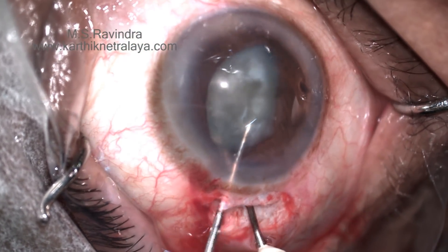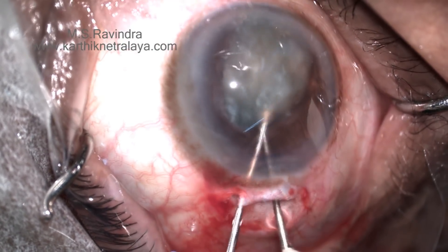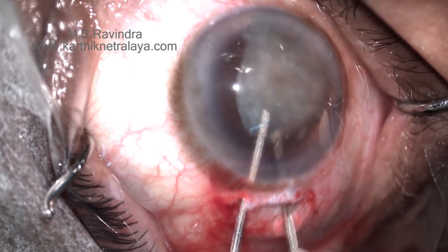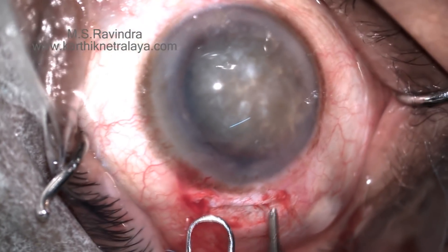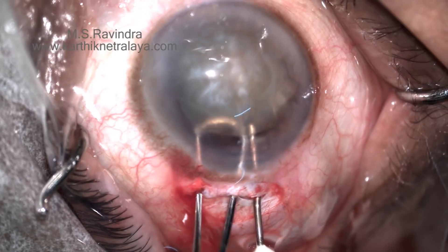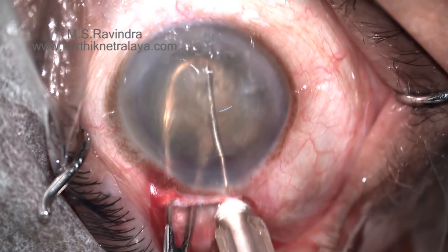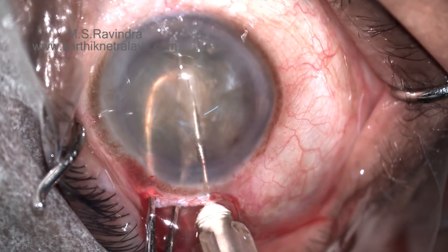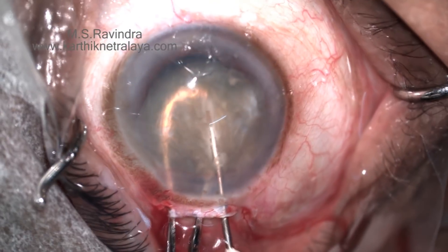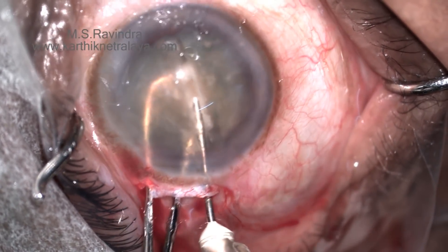The nucleus is cartwheeled into the anterior chamber by manual technique through the small pupil. It is a hard, large nucleus, broken into two pieces with a 26-gauge cannula which is continuously injecting HPMC in front of the nucleus, separating it from the endothelium.